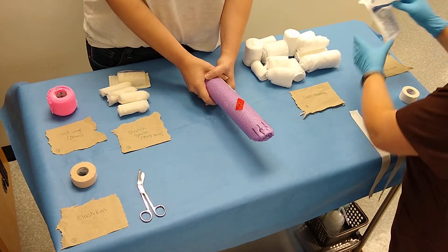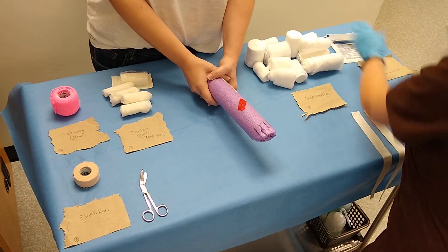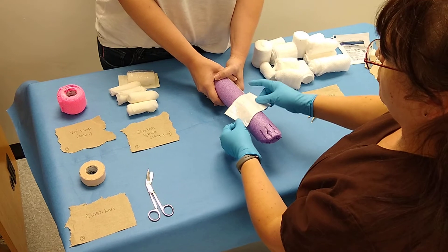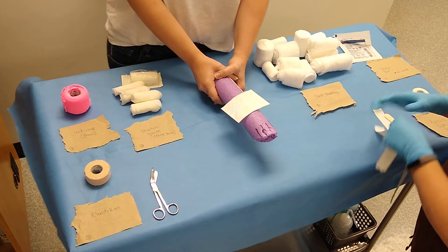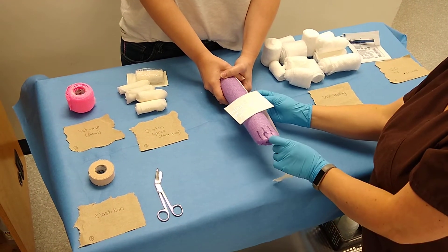If you have a wound on your patient, we're going to go ahead and cover it up so that the bandage material doesn't stick to it. We're going to place our stirrups on.